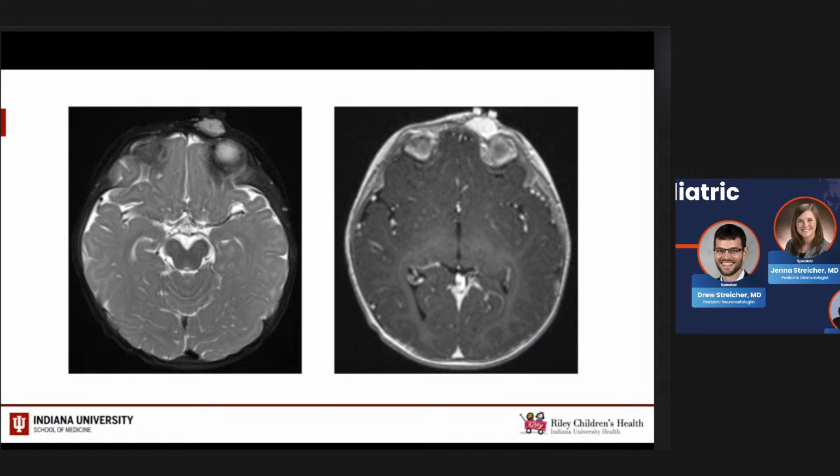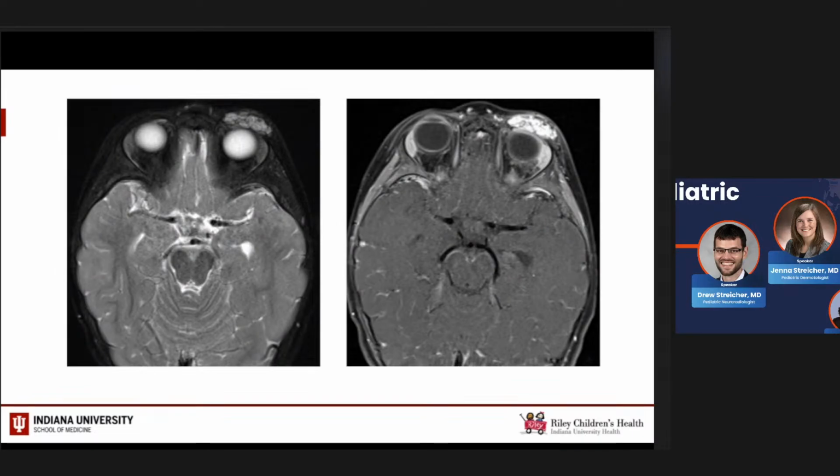But back to infantile hemangiomas. Another example here, left periorbital preseptal region, again a lobulated T2 hyperintense lesion with some internal low T2 foci that look like flow voids, and very avid enhancement on the post-contrast sequence here. There's no post-septal extension. So from our report, we can be pretty confident that that's what this is. Another pertinent point is that we really want to say where this thing's going, because that can impact management. If it's going back into the orbit, we really want to discuss all that: what it's doing to the globe. Is there mass effect, proptosis? Is there compression of the optic nerve, et cetera?